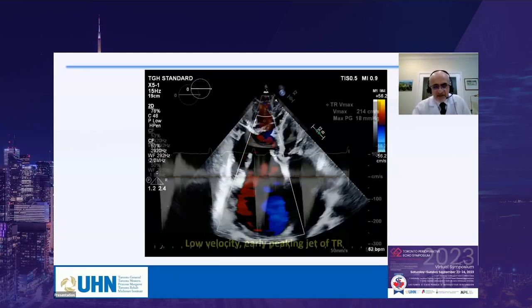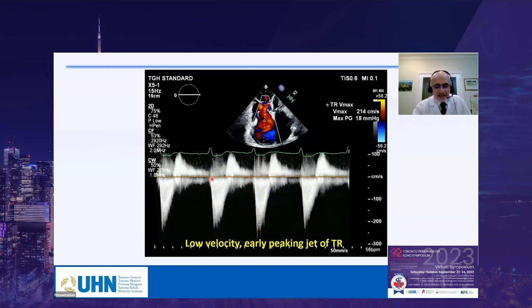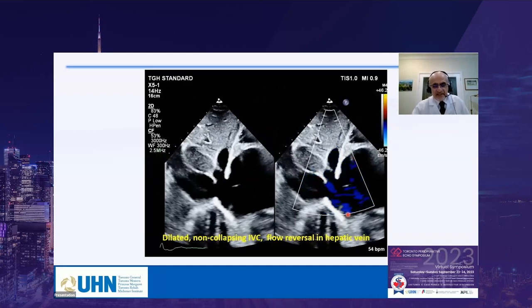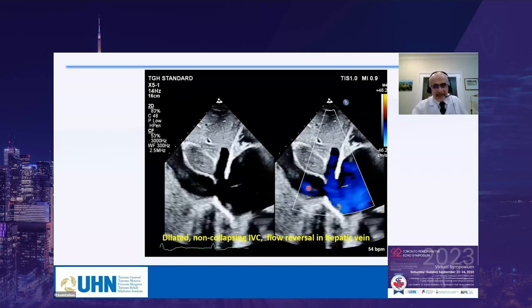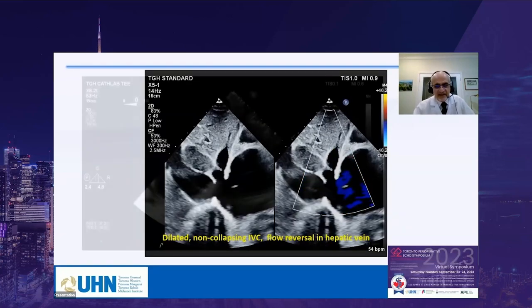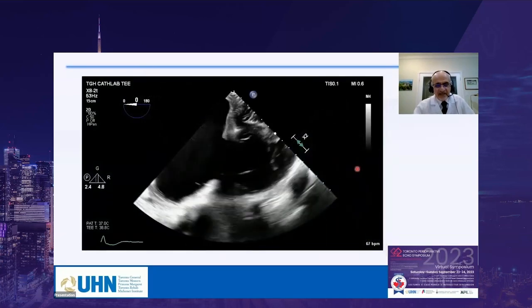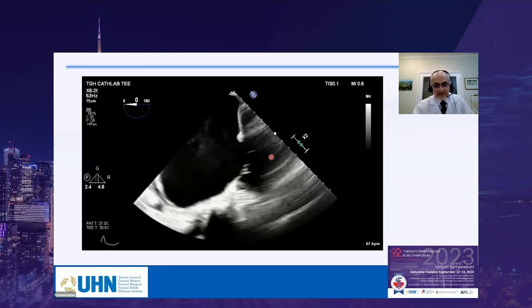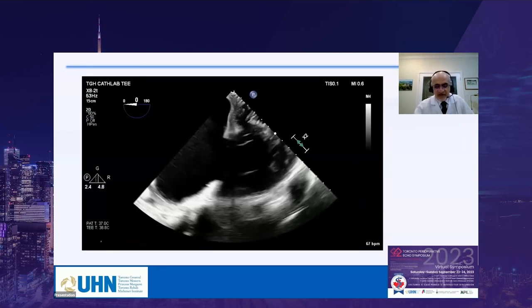The Doppler profile of severe TR shows an early-peaking, triangular-shaped waveform with relatively low velocity, because the pressure difference between the RV and RA is not large in severe TR. The IVC is dilated and there is flow reversal in the hepatic veins. In this case, the transthoracic echo showed the tricuspid valve much better than TEE, where the leaflets were not well visualized.